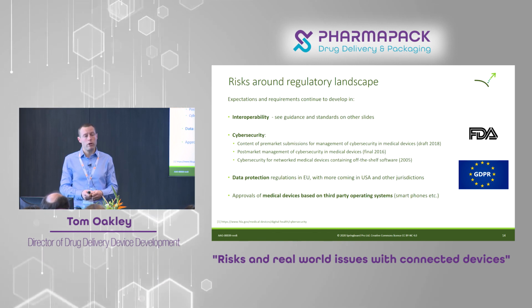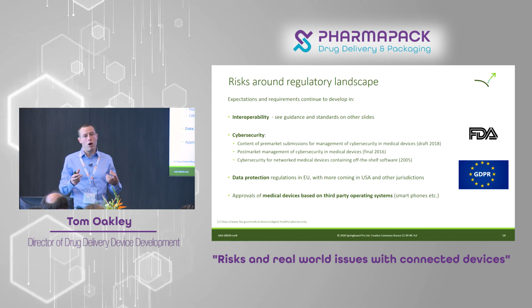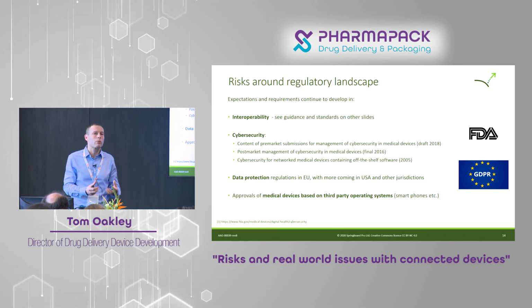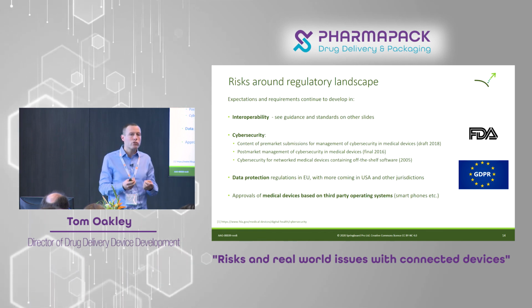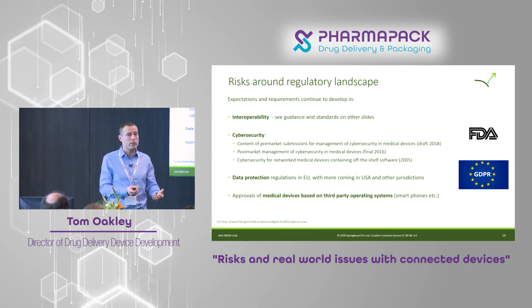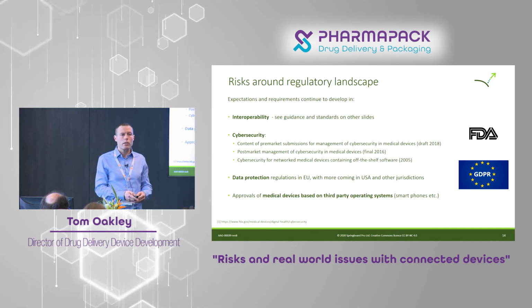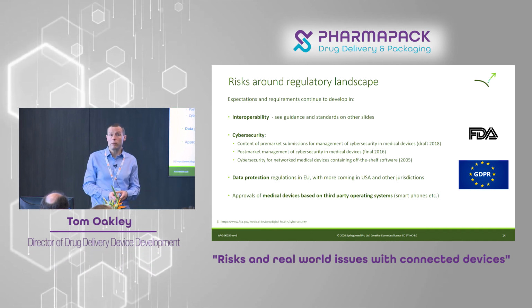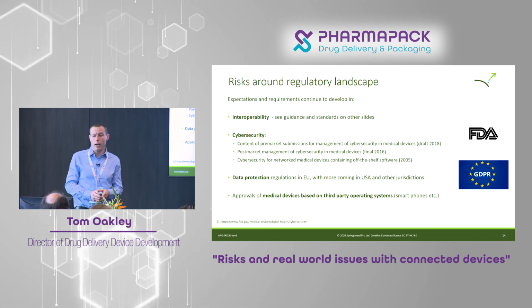And lastly, we've got approvals of medical devices which are based on third-party systems. So the classic one would be a medical device based on a smartphone, where you don't have any control over iOS or over Android or whatever system. It may change under your feet, but how do you deal with that? So the regulatory authorities are putting in place ways of dealing with that, and I'll just give you an example now.